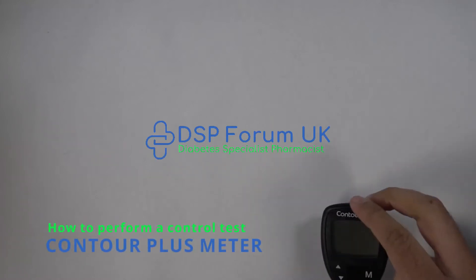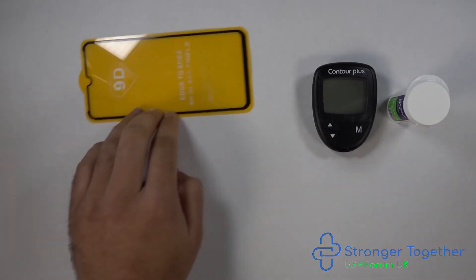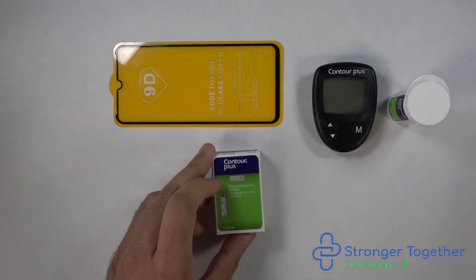In this video we'll cover how to perform a control test of the Contour Plus meter. I recommend you do this when you first get your machine and when opening a new pot of test strips. The control test ensures your test strips are performing within the acceptable limits of your machine.